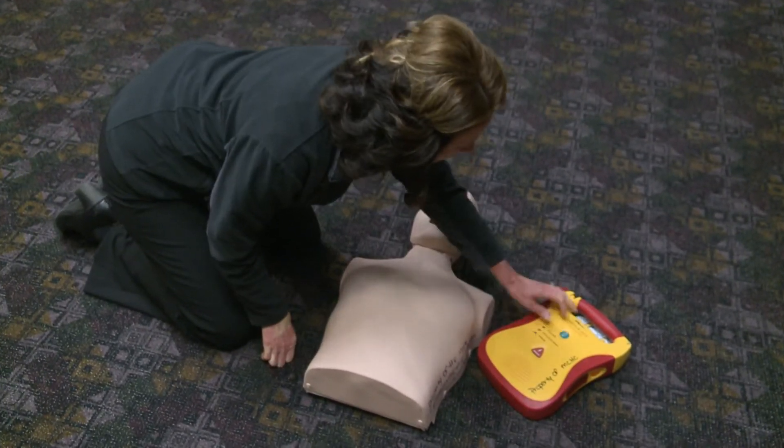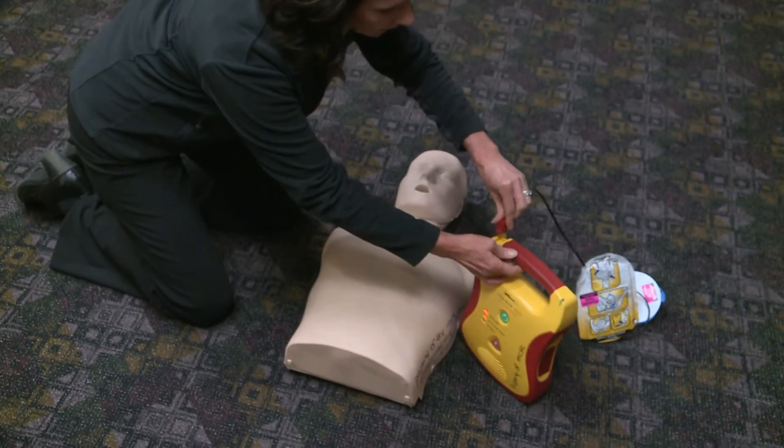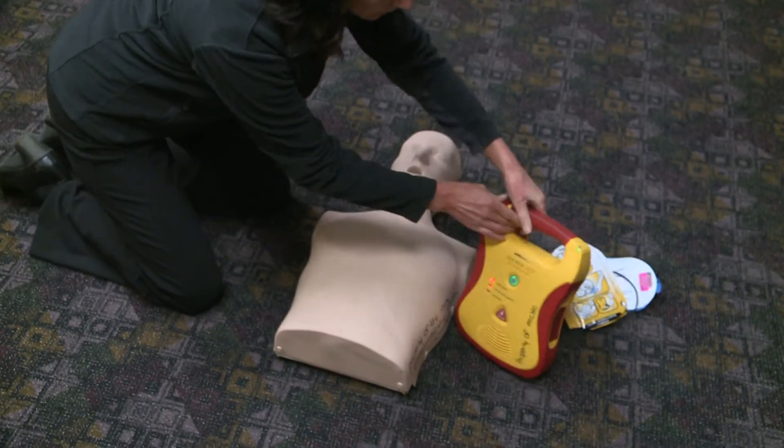Once the AED arrives, turn it on. Call for help. Remove the pads from the package and the back of the unit.